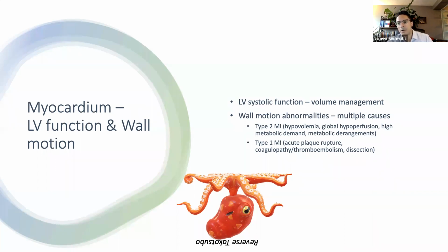And we can also get coronary artery dissection from a type A dissection into the right coronary artery. And then we could also see wall motion abnormalities because of stress-induced cardiomyopathy, as we saw in the previous picture. And it's important to recognize this because knowing whether or not there's a potentially vulnerable myocardium can help to plan the resuscitation and improve the overall chances of survival.